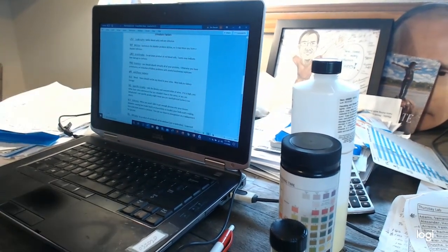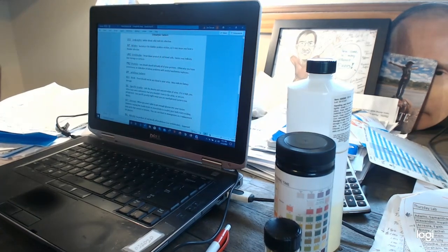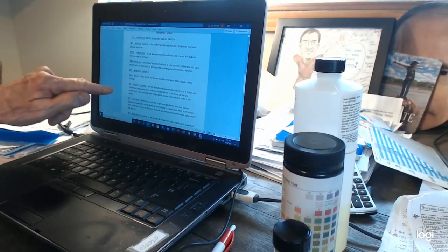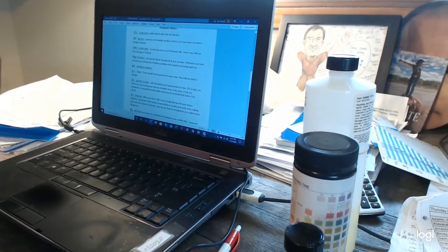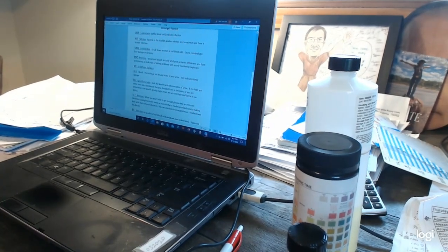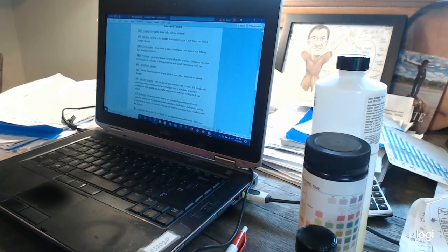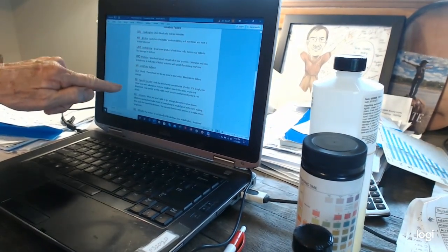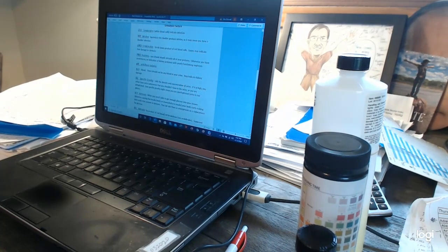Your pH should be slightly acidic, somewhere between maybe 6.0 and 7.0. You shouldn't have proteins. You should be reabsorbing all of your proteins. Specific gravity. Remember, that's how heavy your urine is compared to pure water. So urine compared to pure water, if it's a little bit heavier, then you're probably dehydrated. It could have other constituents in it that are making it heavier, some extra proteins or things. So sometimes high protein might mean high specific gravity, but usually it relates to your hydration status.